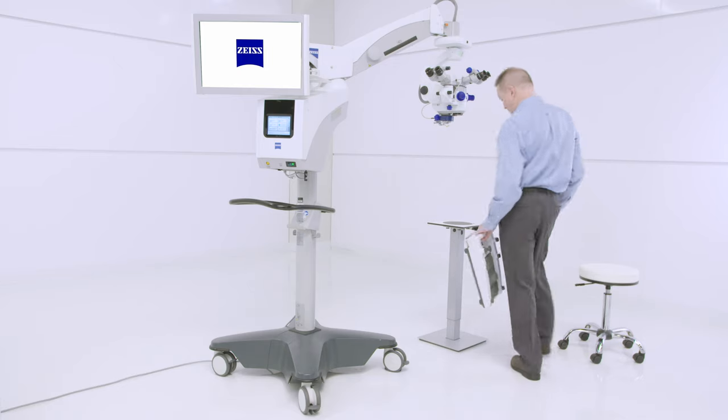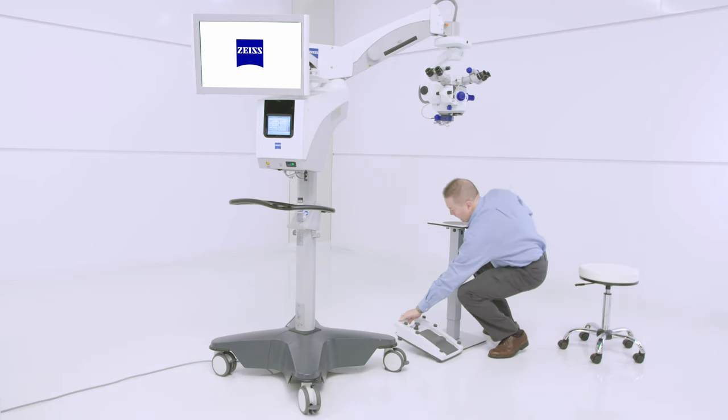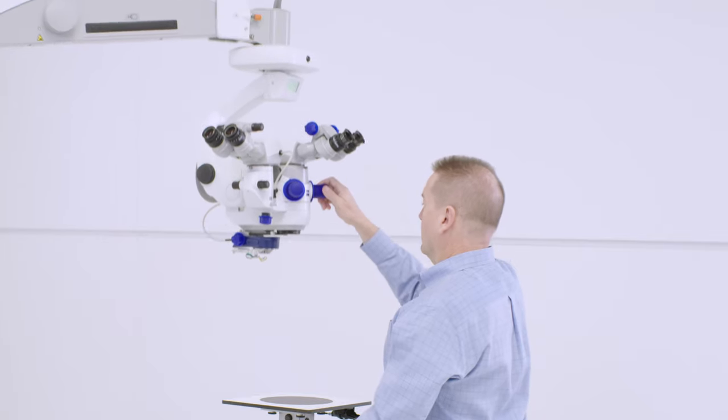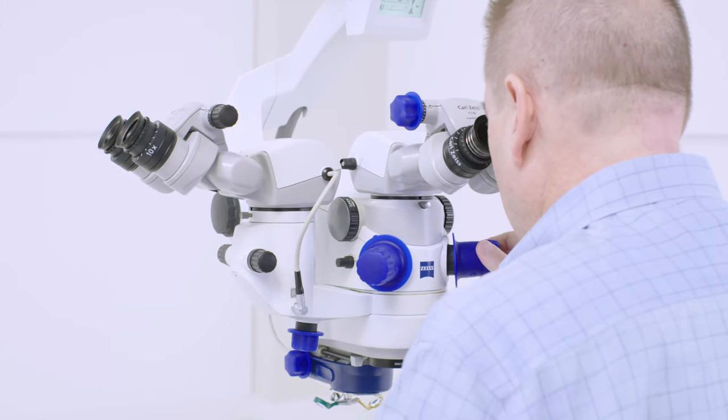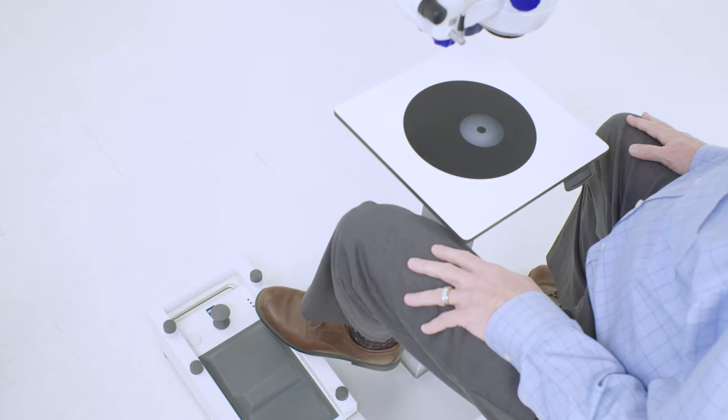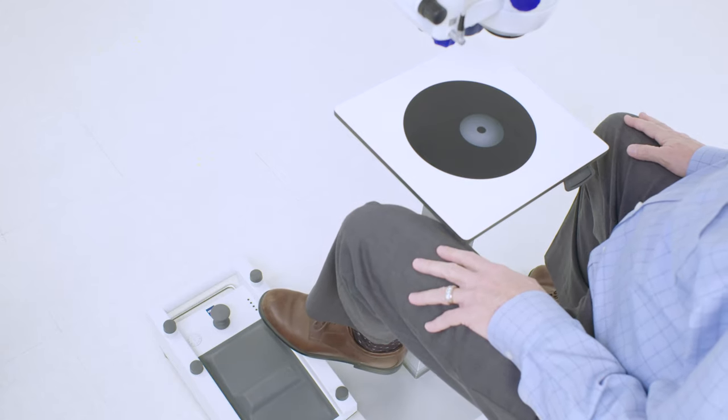Place the foot control panel on the floor near the microscope. Reach up to the microscope head and use the hand grips to release the brakes. Pull the microscope down to its working position and then select the switch or switches that you programmed to verify they are correct.